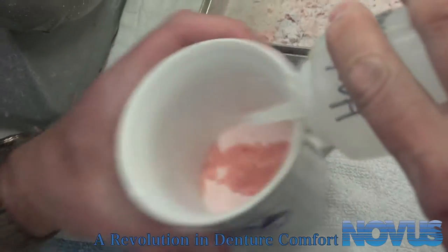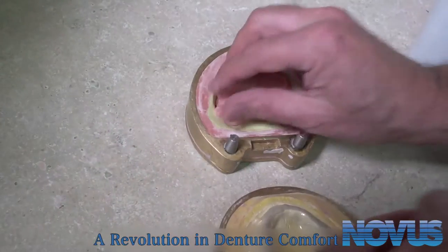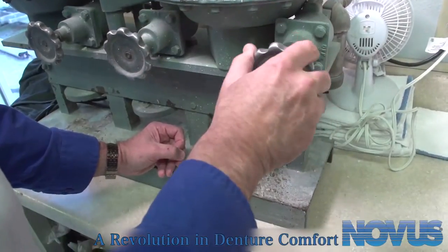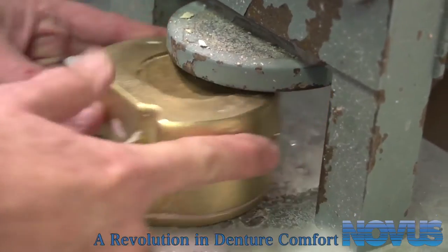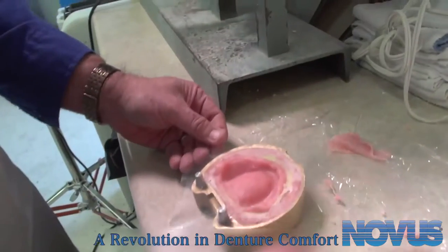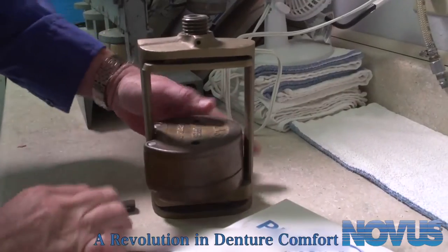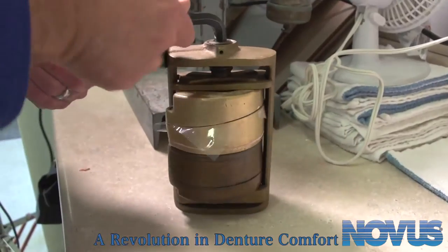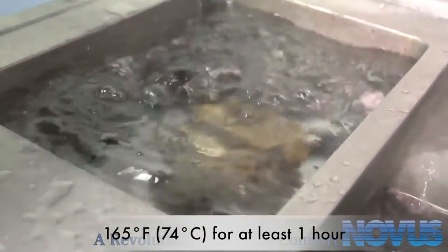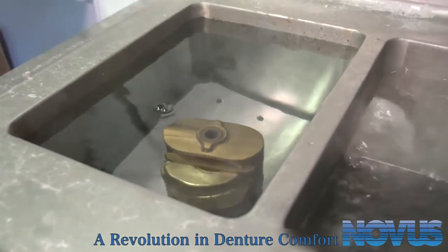Next, mix the acrylic according to the manufacturer's specifications. Trial pack and pack traditional heat-cure denture acrylic. Cure the acrylic at 165 degrees Fahrenheit, 74 degrees Celsius, for at least one hour following the manufacturer's mixing specifications.